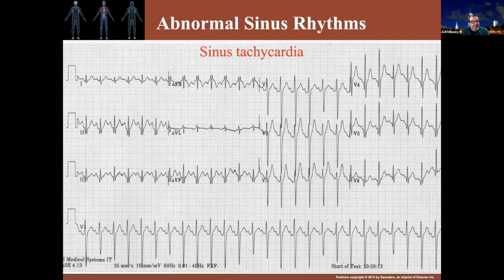How do you detect the presence of sinus tachycardia in an EKG tracing? Well, if you look at this tracing, you'll find the P waves are normal. You have nice, normal little P waves here. There will be no abnormality in the QRS complex, so the QRSs look quite nice. The rhythm is regular, but the rate is fast, and so the waves look much closer together.